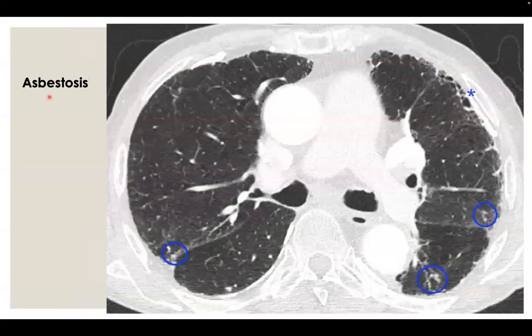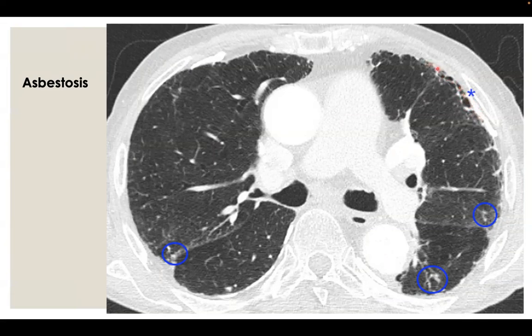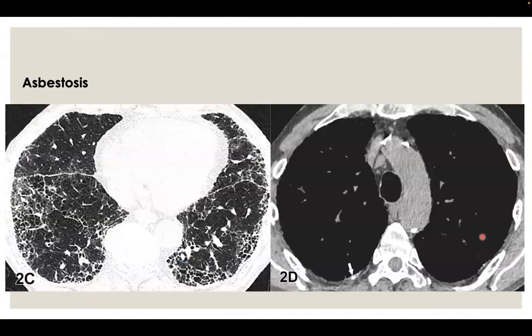In the case of asbestosis, a single layer of stacked cystic structures stacked along the pleural surface is shown, with the presence of calcific pleural plaques — this renders the UIP pattern as an alternative diagnosis, which is asbestosis. Another example shows honeycombing along the lung bases subpleurally, but the presence of calcific pleural plaques makes the diagnosis asbestosis. And that's it — thanks.